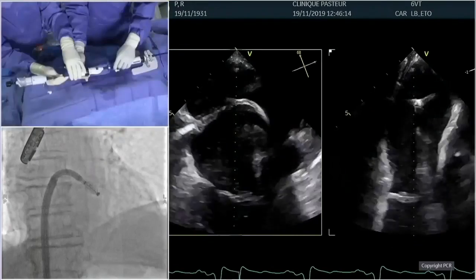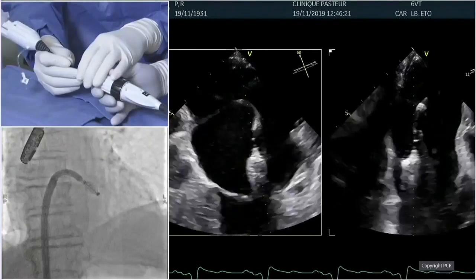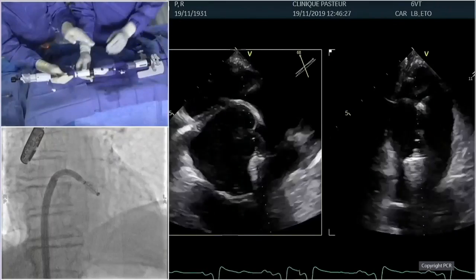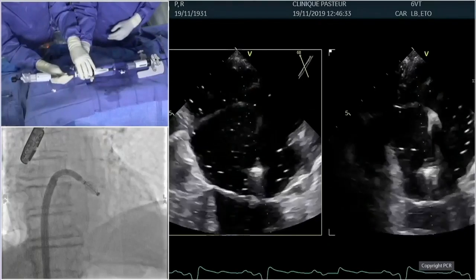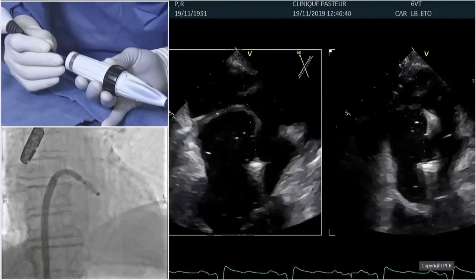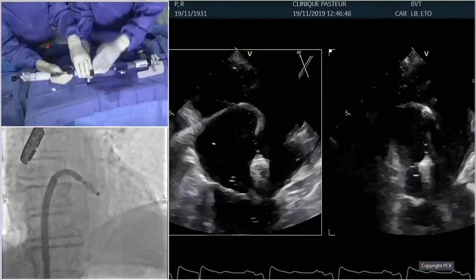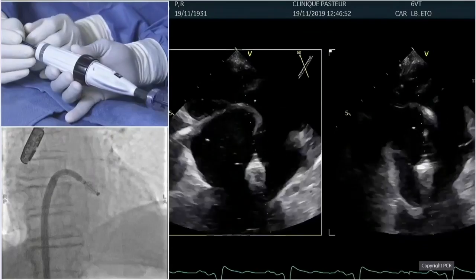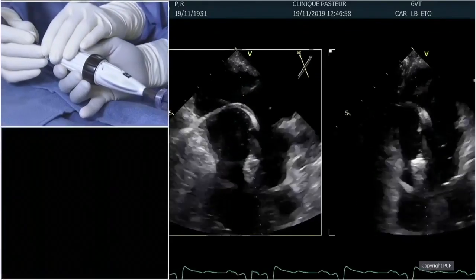So with small movements, you see that I'm diving in a quite coaxial direction relative to the long axis of the left ventricle. But we have some small corrections to do. On the right image, we see that we're against the posterior valve, so we're going to go a little bit anterior, so counterclockwise with the steerable. And on the right image, the overall trajectory looks good, but we are maybe a little bit too lateral. So I'm going to add a little bit more flex on the steerable just to be more perpendicular. And maybe you will have to pull a little bit on the steerable catheter to go a little bit more medial. Okay, so let's see on fluoro how it looks.